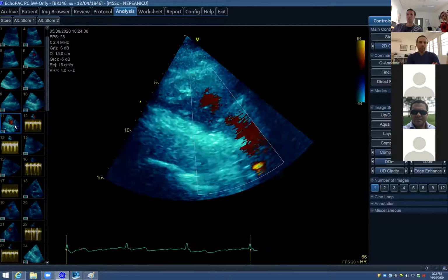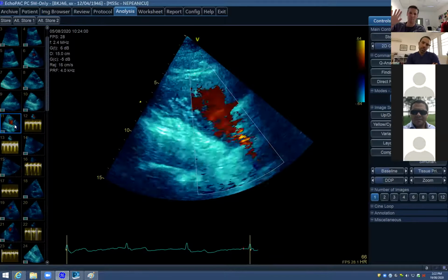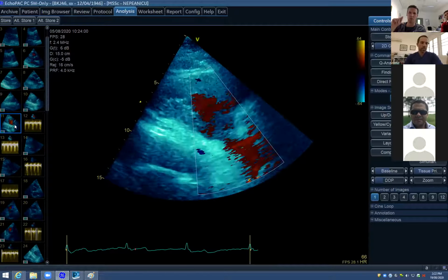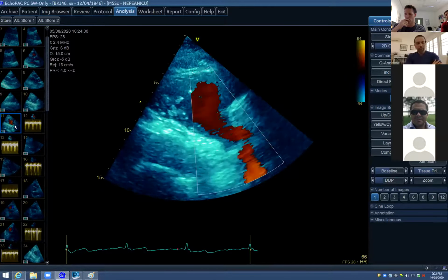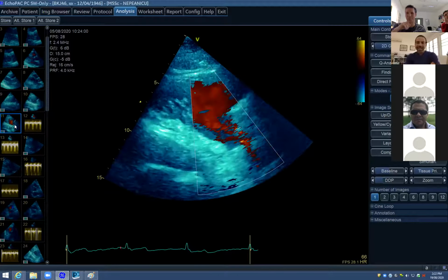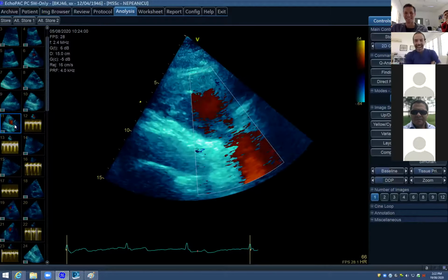All right. So let's go and have a look at pulmonary hypertension. Let's first talk about systolic pulmonary artery pressures. Ben, how are we going to assess systolic pulmonary artery pressure in this patient? Assuming we're not doing things invasively, assuming we're doing things non-invasively. Yep. Yeah, he's in ICU. Remember, we're doing a tutorial. Yeah, definitely. How do you do it with echo?